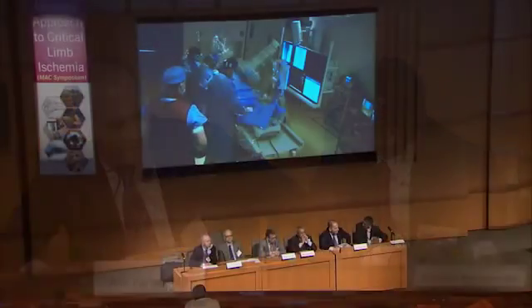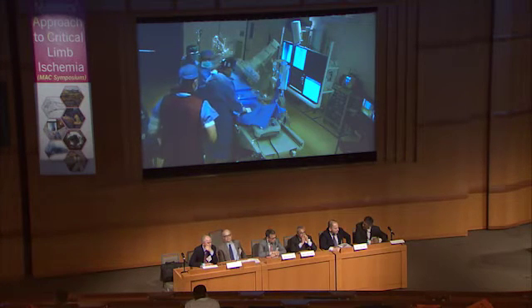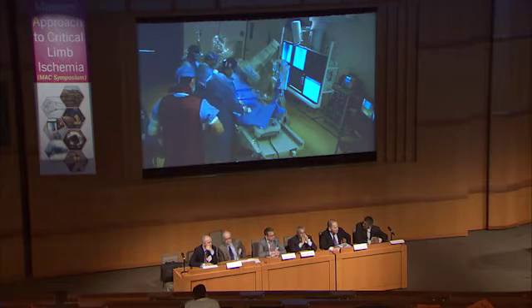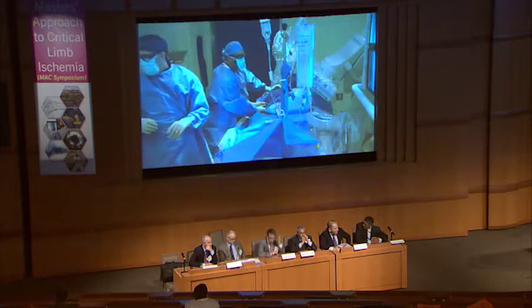You're going to have to evaluate it better, maybe with an MRI, and probably go through the profunda and identify the feeders and treat them. You may have to do this in several sittings because these things are very difficult to treat. They come back. But I think you have to treat it to give this patient's foot the best chance to heal.